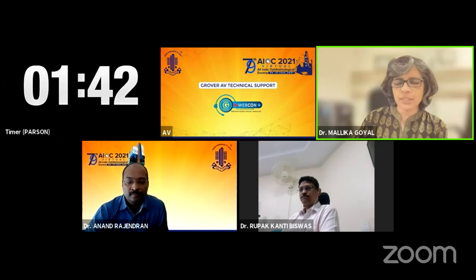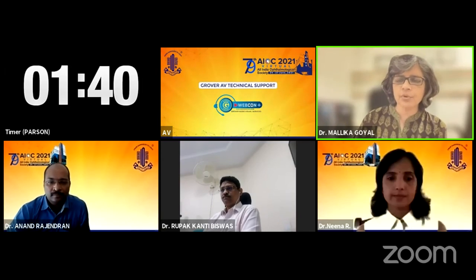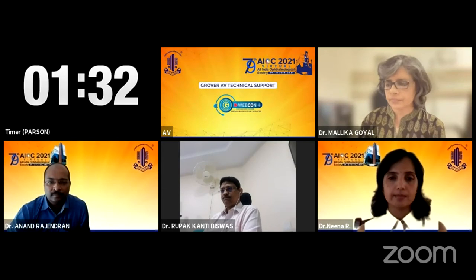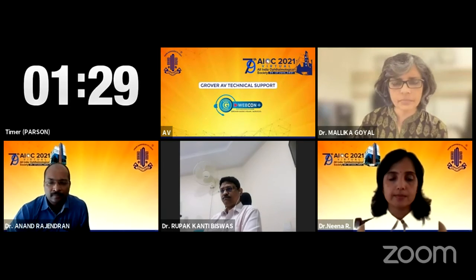But are you able to say that this particular case is going to progress faster than the other case based on your findings, based on these imagings? No, ma'am. We have not found that. Only the EZ disruption and the ELM disruption that we have seen in higher stages.